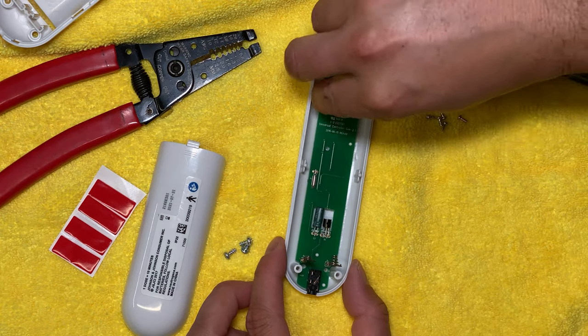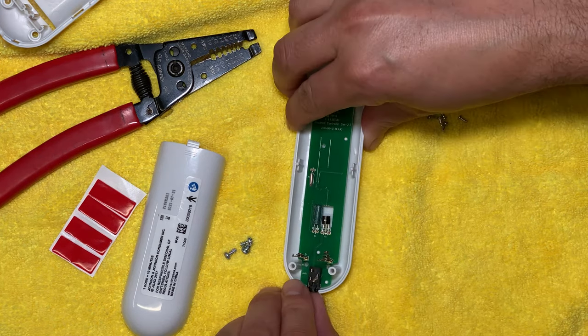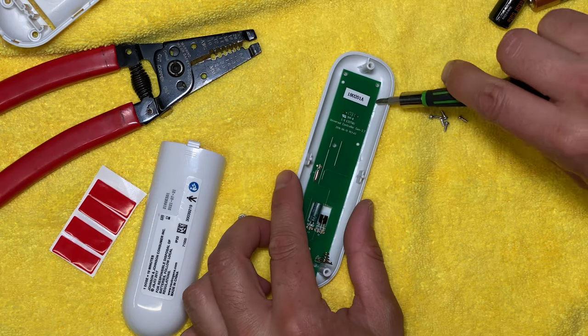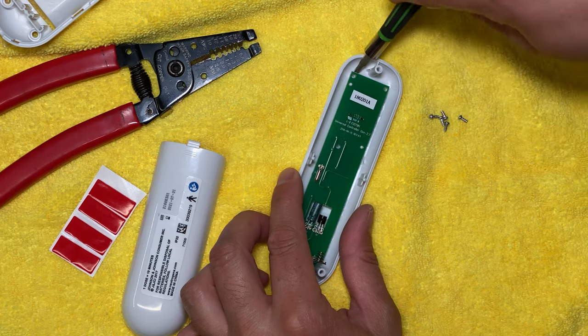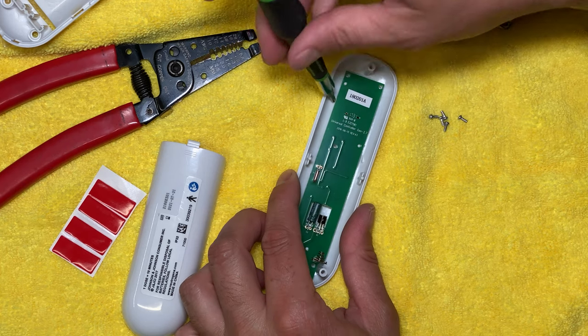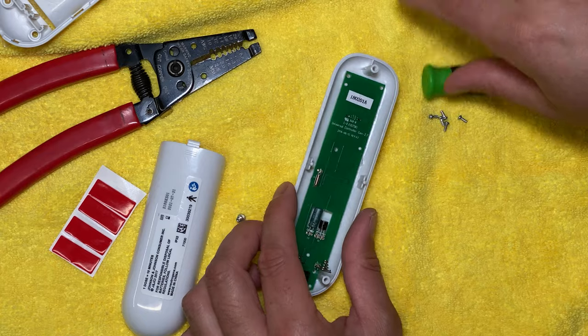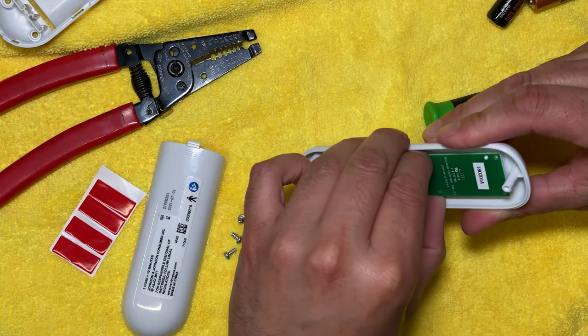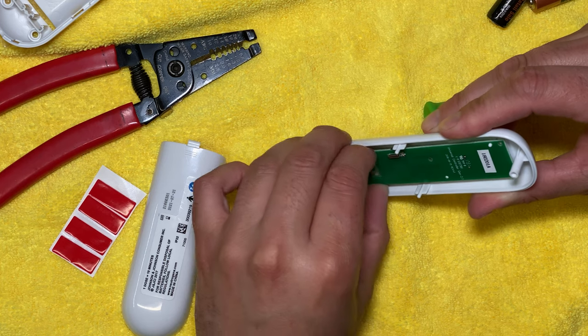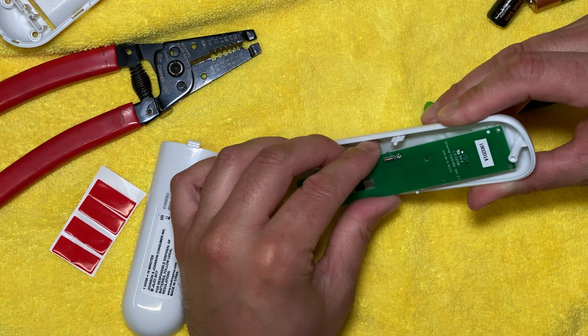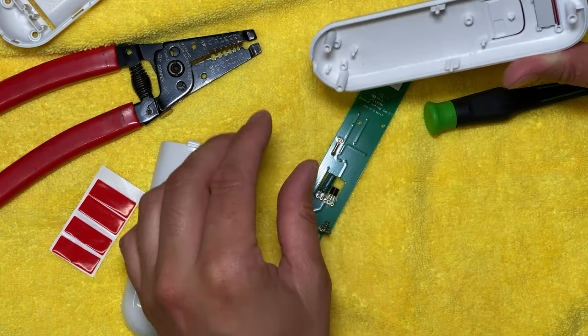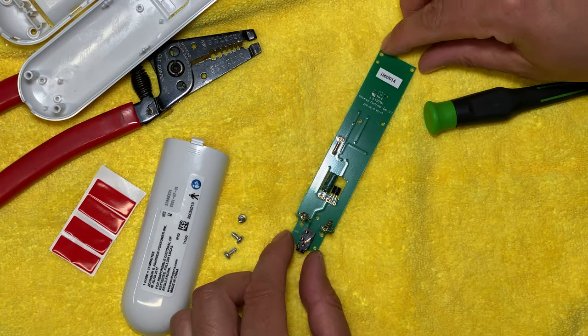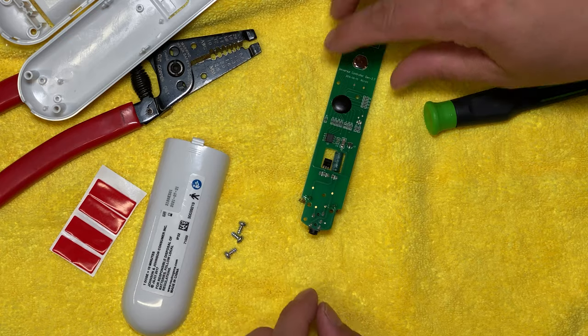Okay, all screws are removed. We're going to lightly pry this out. It did like to stick on one of those little white plastic knobs there, so go gentle. You don't want to crack the circuit board. Okay, circuit board removed. We need to flip it over and then flip it the other direction.